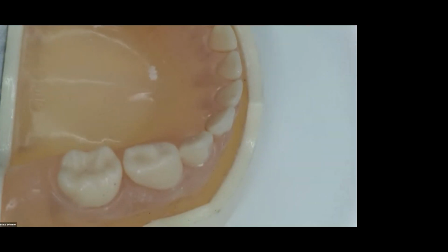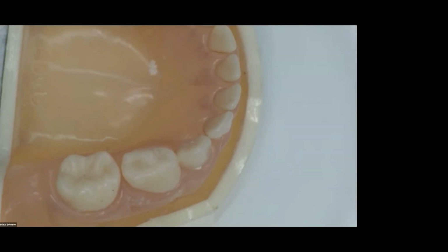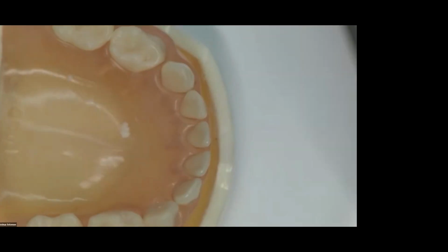So my patient, and I'm going to pretend that this is my patient sitting in the chair. I'm just going to rotate a little bit like this. Okay. So we're going to go ahead and deliver an injection, and we're going to numb S and T here. And I'm going to just grab my pedal and walk you through this.